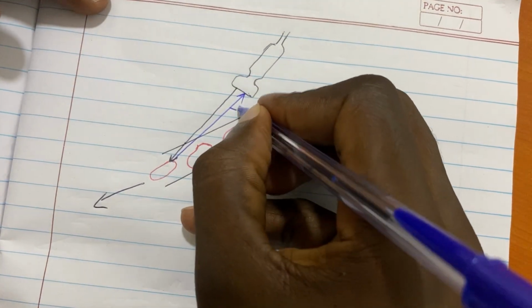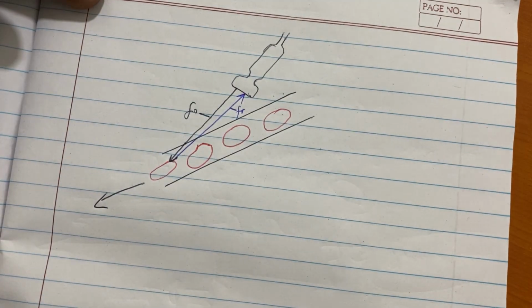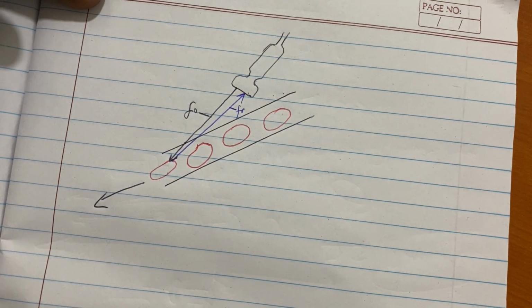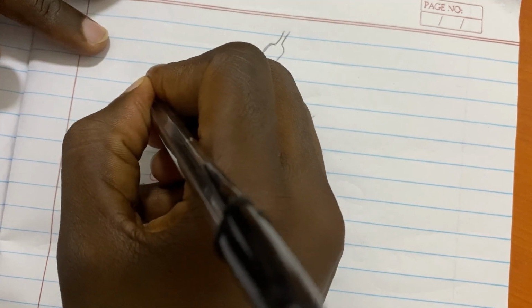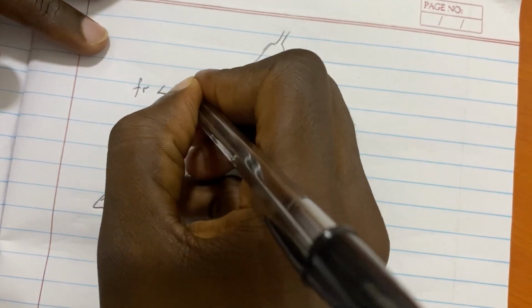This is FR, and this is F naught, the transmitted ultrasound. Since this red blood cell is moving away from the probe, FR will be less than F naught.